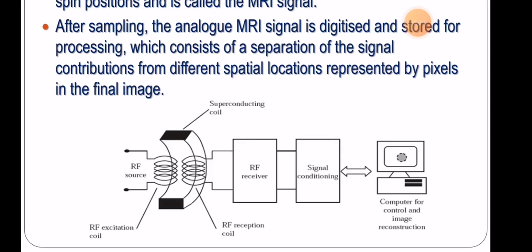The MRI image is formed digitally, as a mosaic of pixels, and each pixel has two properties, character and position, and the character refers to the pixel intensity on CRT or film. White is assigned to high signal intensity and black is assigned to those pixels having low signal intensity. Producing an image from signal requires that a specific slice within the patient body is examined and voxels be designated within the slice. So that is all from my video.